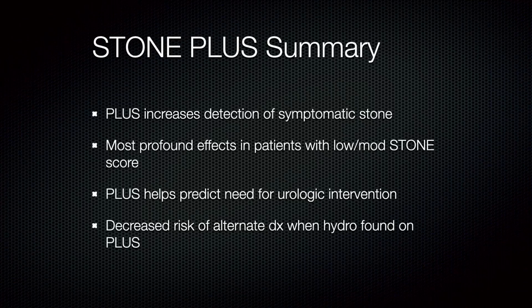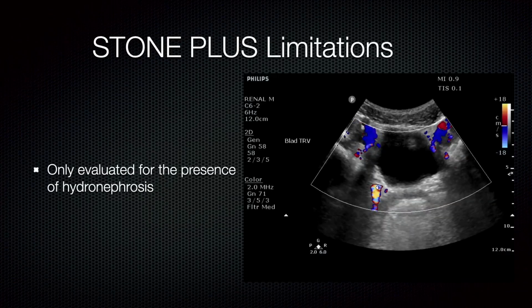But there's one glaring limitation of this study that I could think of right off the top of my head, and that is it only evaluated for the presence of hydronephrosis. Did you guys notice that?